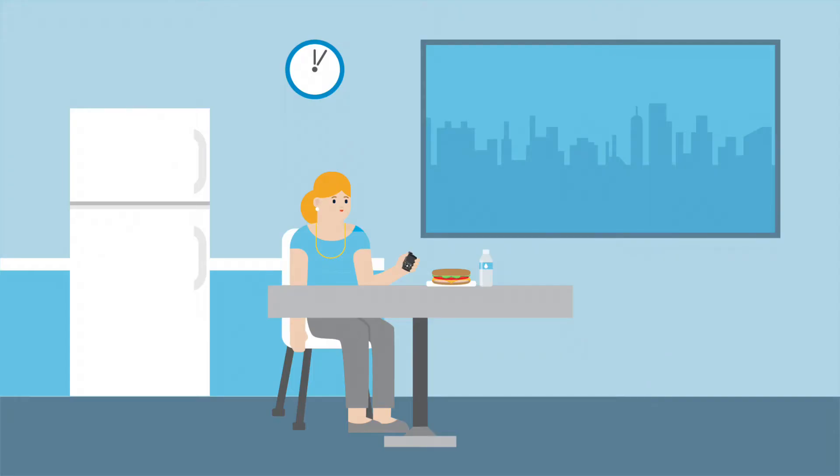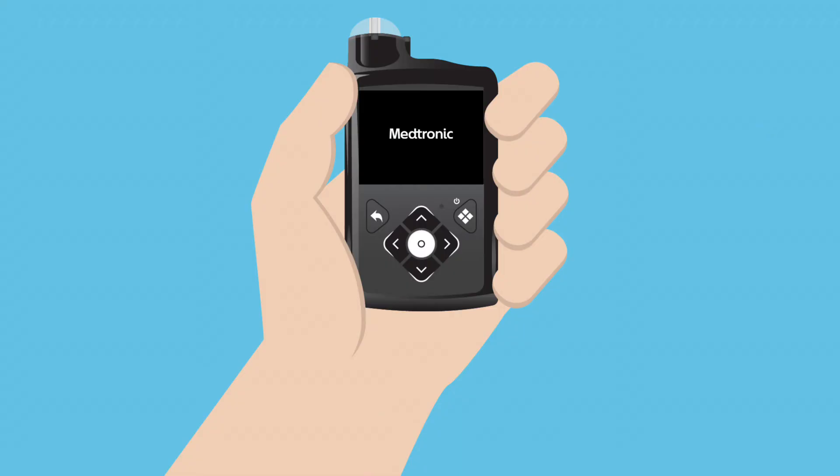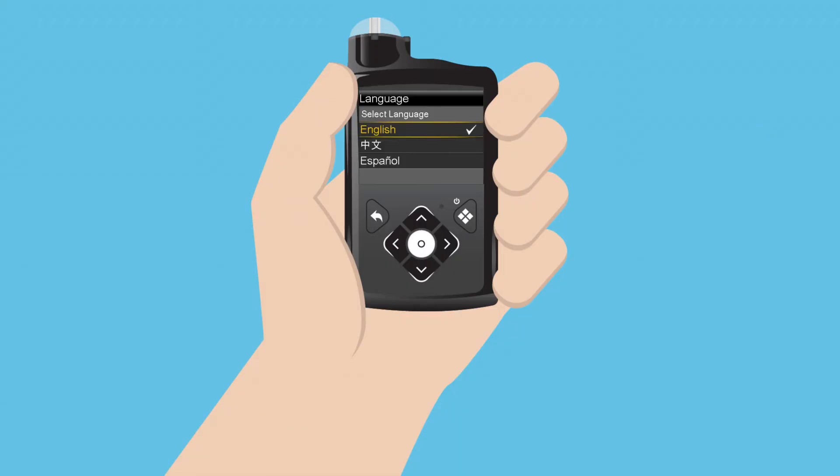Clara sees the pump turn on and display the first screen of the startup wizard. The startup wizard will guide her through setting the language, the time format, and the current time and date.